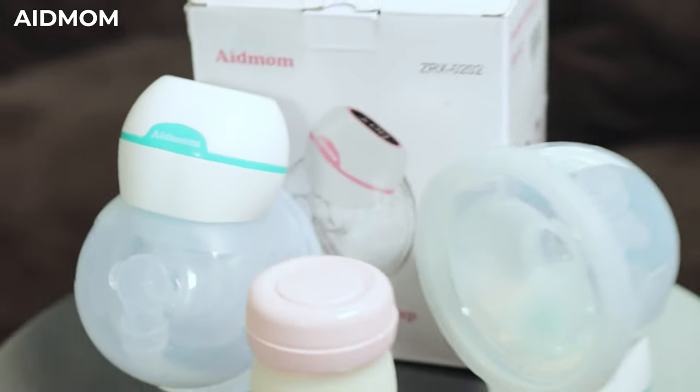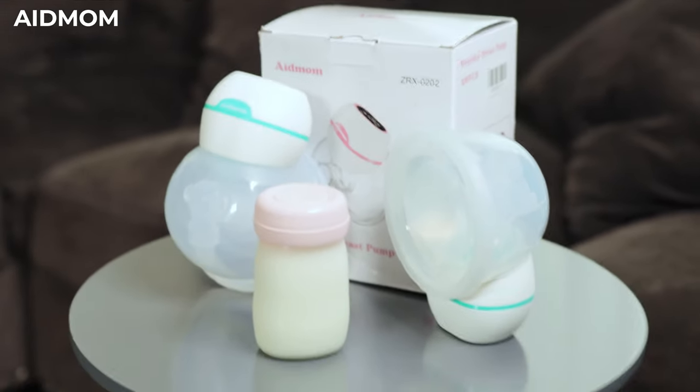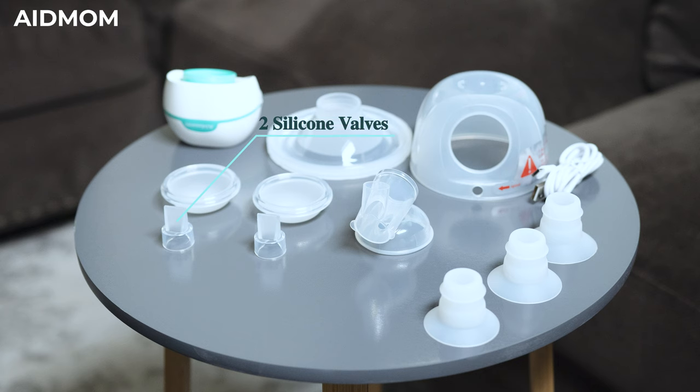Our 8mom double is a hands-free portable electric breast pump. Each breast pump comes with two silicone valves, two silicone diaphragms, a linker, 28, 24, 21, and 19 funnel inserts, a USB cable, milk collector, breast shield, and the pump motor.